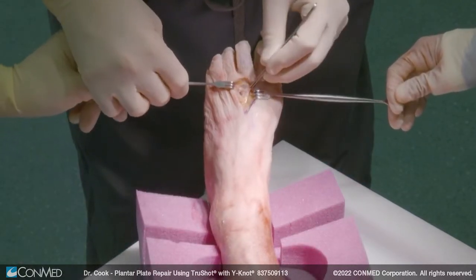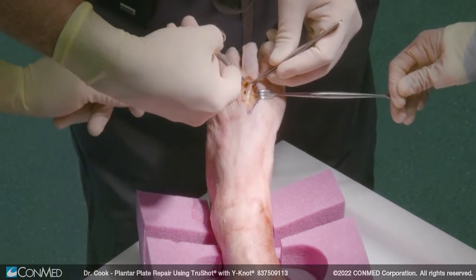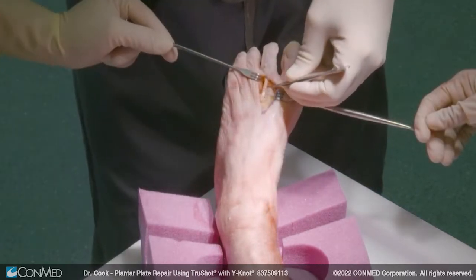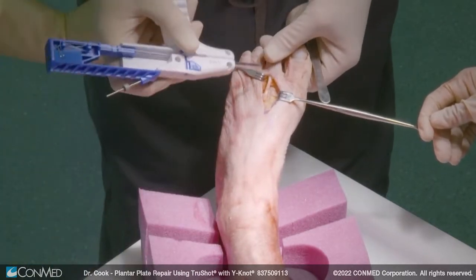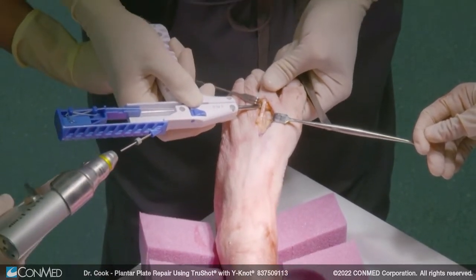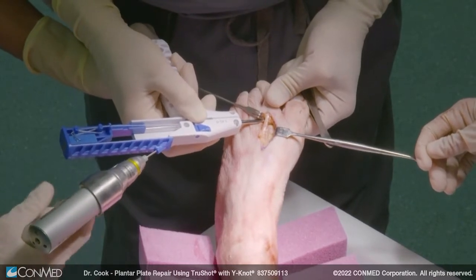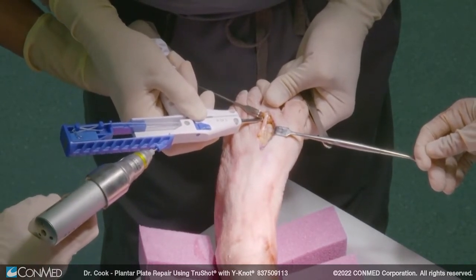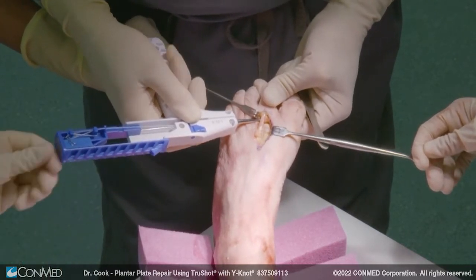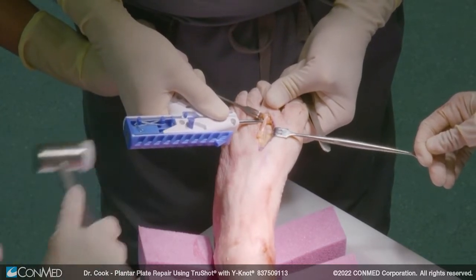We're going to go back in and place TrueShots into the base of each proximal phalanx. The TrueShot is coming in right at the base of the proximal phalanx. I angle a little distal, a little bit inferiorly, and we're just going to drill it in.